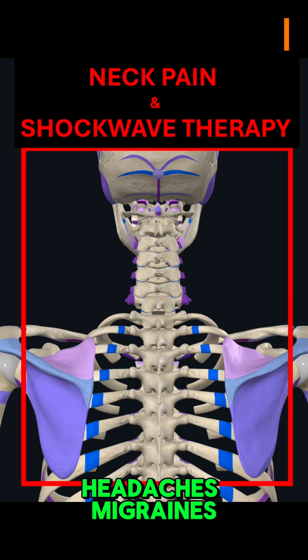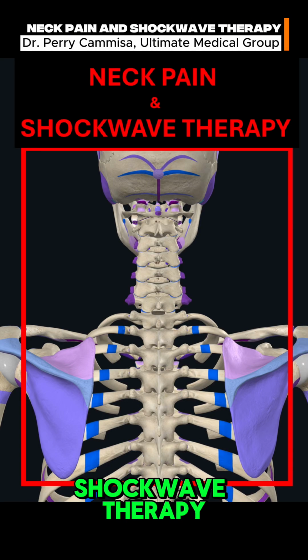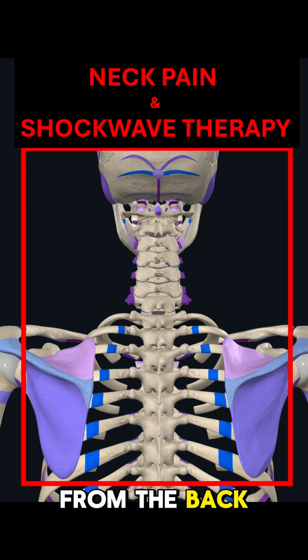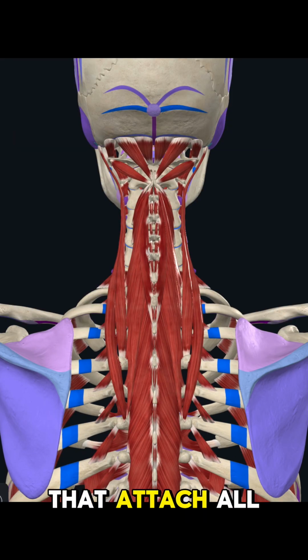From neck pain, headaches, migraines, one of the things you want to think about is getting some shockwave therapy. And here is a picture of the skeleton from the back, and everything in the red box is a target area. It doesn't mean that this entire area needs to be treated, but it needs to be checked because there's muscles that attach all the way.